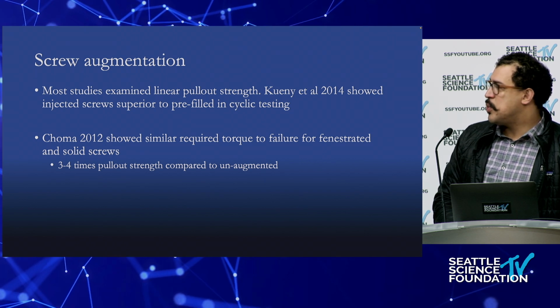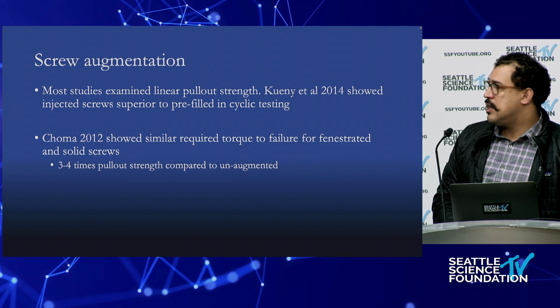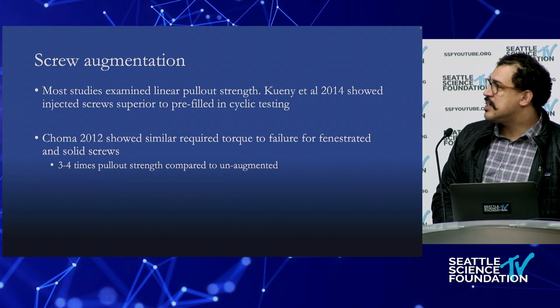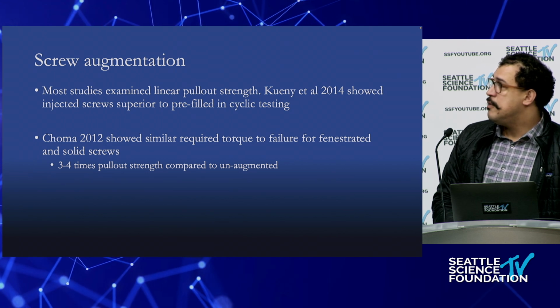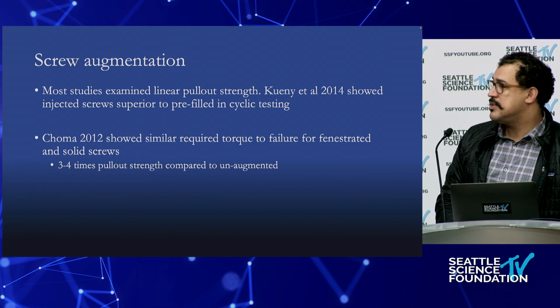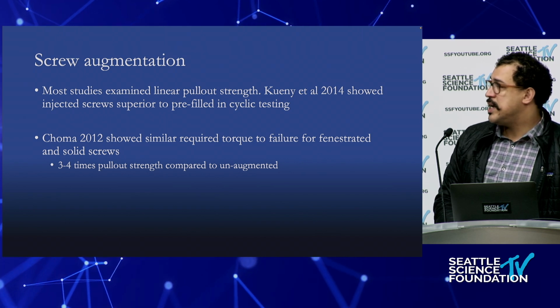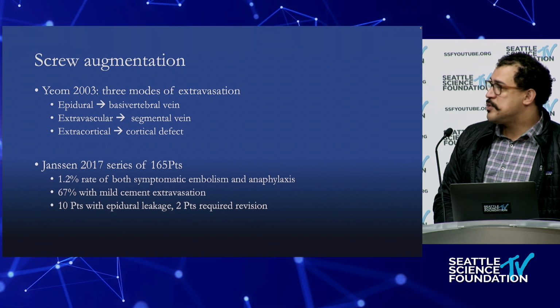This is just a couple more studies where they looked at torque to failure with fenestrated and solid screws. Not a significant difference between solid, but they did see some improvement for the fenestrated above the solid, but both were 3 to 4 times greater than an unaugmented screw without cement. And I just wanted to talk about this briefly.